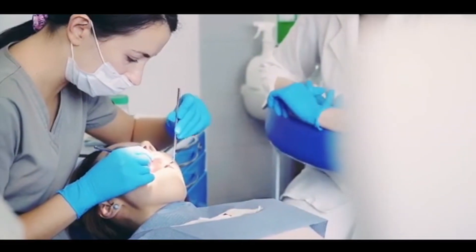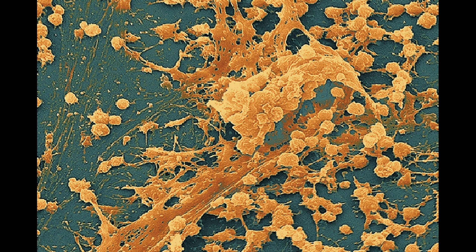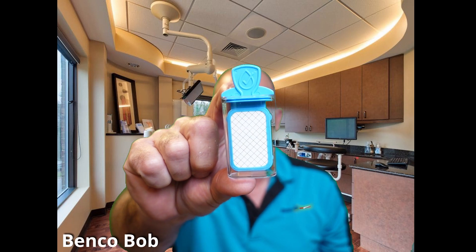A few disease-causing microorganisms found in untreated dental unit water include Legionella and non-tuberculosis mycobacterium. So how do you know if you have biofilm? The only sure way is to test your dental unit waterlines on a regular basis. ProEdge has the Quick Pass Test, which is very simple and easy. You do it in your office, it's inexpensive, and you get accurate results in 48 to 72 hours.